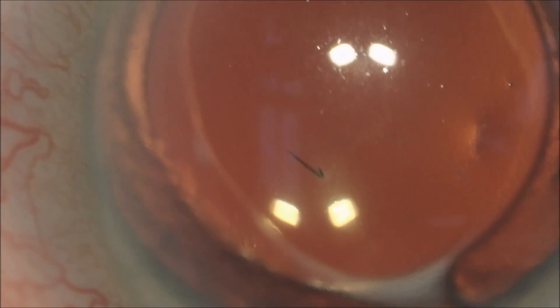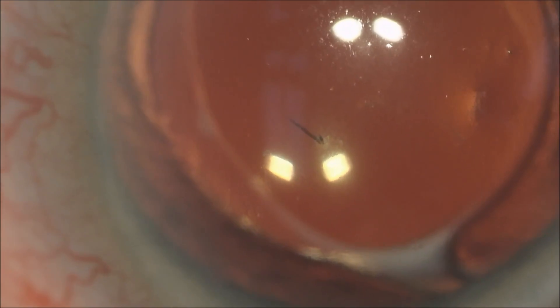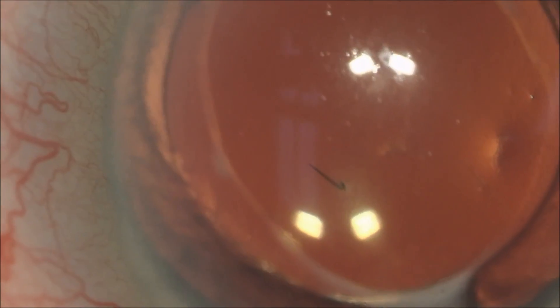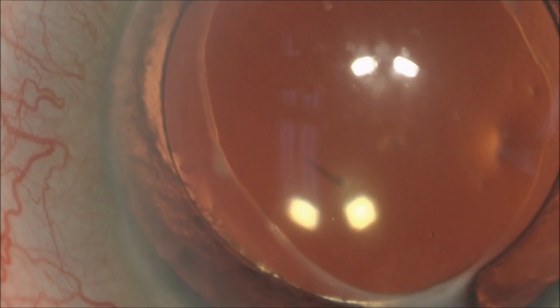As we zoom up further, we can see the barb holding the stinger deep in the patient's cornea, with the spike of the stinger actually entering the front part of the eye. It was impossible to remove this exteriorly from the outside of the eye, secondary to the deepness of the stinger.